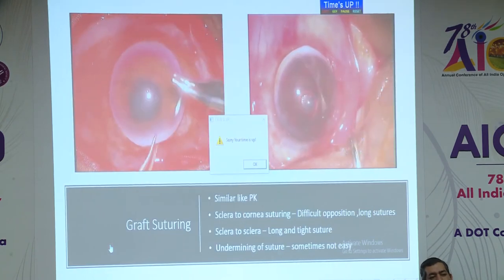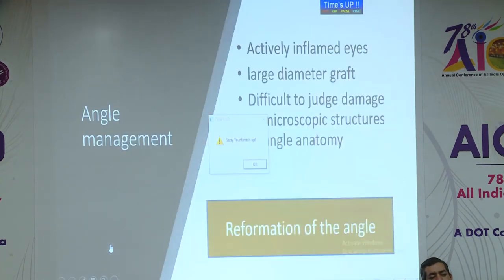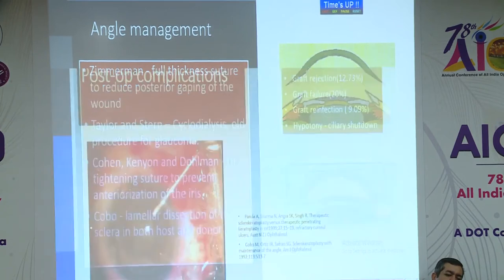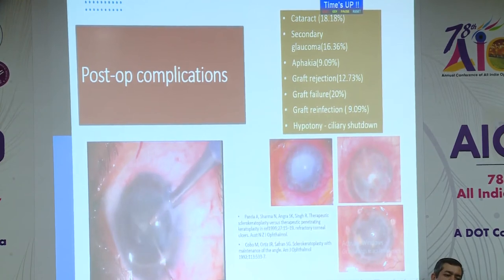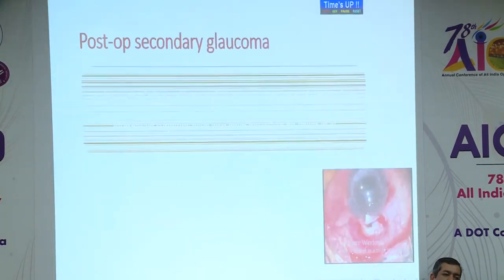Graft suturing is similar to penetrating keratoplasty. Sometimes it is difficult to manage the sclera to corneal suturing. Angle management is very difficult and very crucial in these cases. Lamellar dissection is preferred as it preserves the angle structures. Postoperative complications can be managed: in case of cataract, we can perform phacoemulsification and even manual SICS, with care taken to prevent damage to the corneal endothelium.